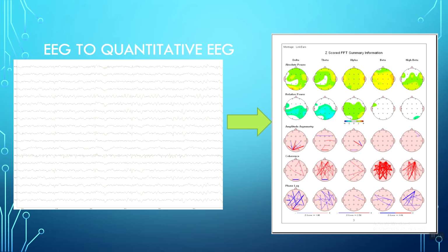And the reason I use this analogy is because the seminal text, the raw data, is absolutely the most rich, the most full of meaning. There's many things that you can read from the raw data that you can't read in the map data. But we have to start with a basic translation. We all do, right? Because we can't read Sanskrit right out the gate. We have to understand what it means first. And so this lecture is largely about how we process the raw data, moving it into this and what it all means.